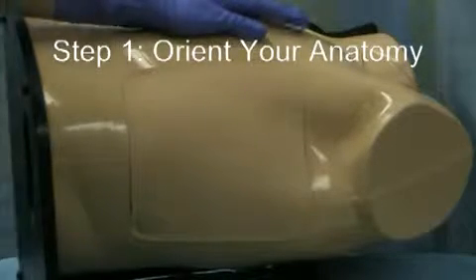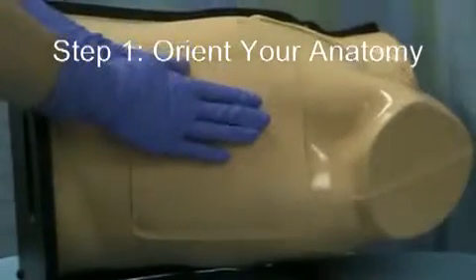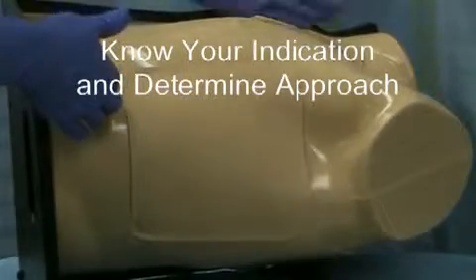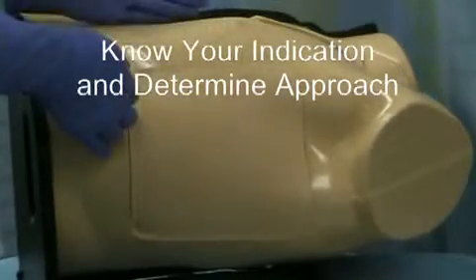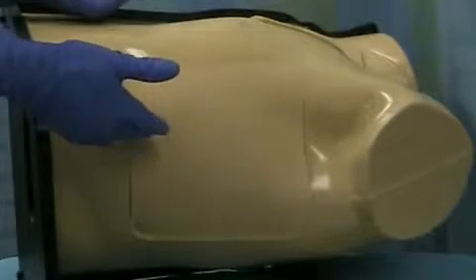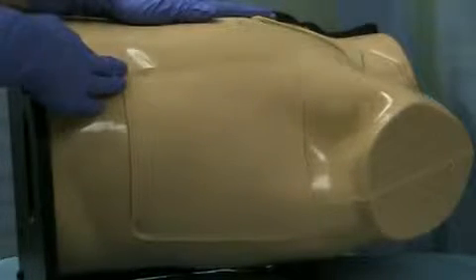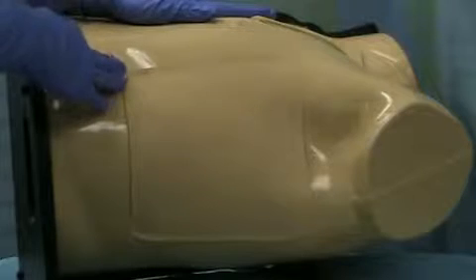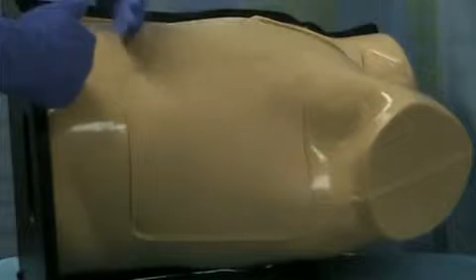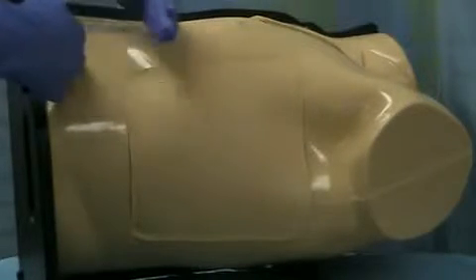All right, so when placing a chest tube, the anatomy things that we look for. Obviously, we're placing the chest tube into the patient's chest cavity to relieve some sort of abnormality, be it air from a pneumothorax, tension or simple, or maybe fluid or blood has built up from various processes. However, we also need to remember that there are several very important vital structures within the chest that we need to make sure we avoid, and also remember that there is an overlap between the abdominal and chest cavity, and certainly don't want to place a chest tube into the abdominal cavity or into any of the abdominal organs.